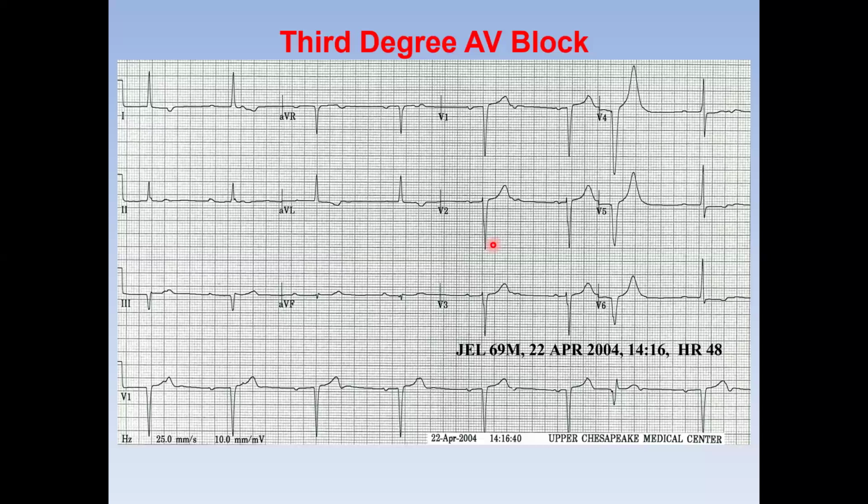How about this one? These are the tricky ones. If you look at it suddenly, you'll think this is sinus bradycardia with first degree block. But look carefully: the PR is actually changing, and over here I can see another P wave. So it may look like sinus bradycardia with first degree block, but actually it's complete heart block with a narrow QRS escape rhythm. This is a patient where, if a pacemaker is finally decided on, I would not put in a temporary pacemaker. I'll just go ahead, because the QRS complex is narrow.